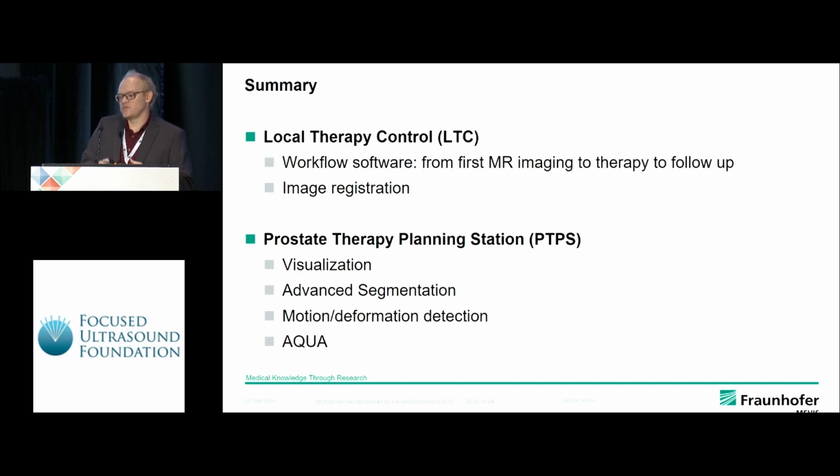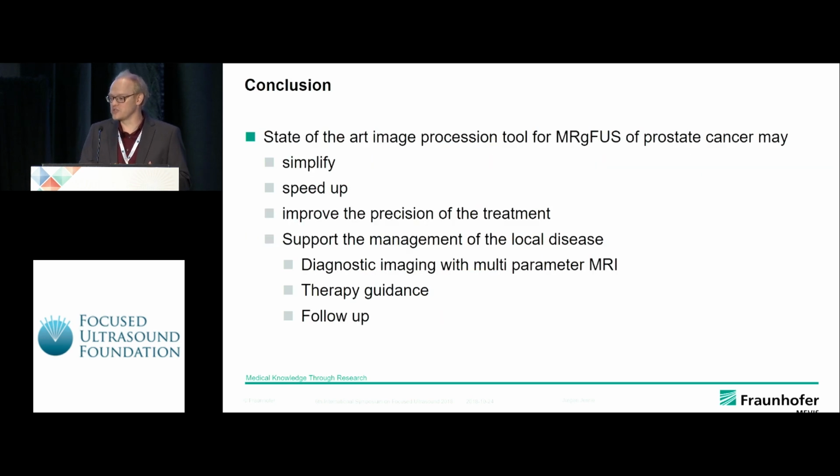So in summary, we have two work packages: local therapy control for accompanying the whole therapy from the diagnostic and so on, and a second, prostate therapy planning station with visualization, advanced segmentation, motion deformation detection, and quality assurance tool.